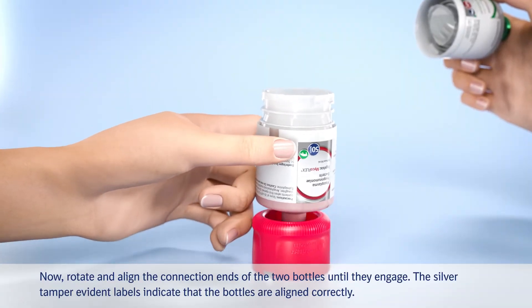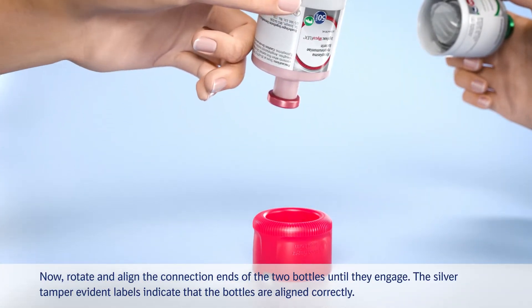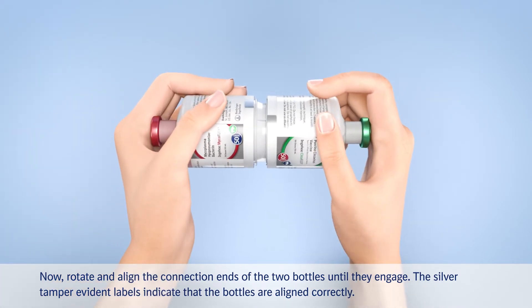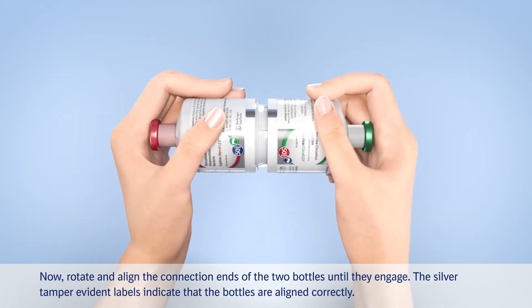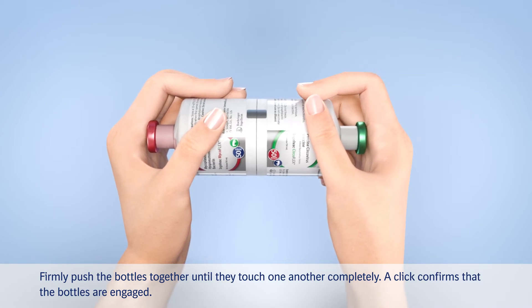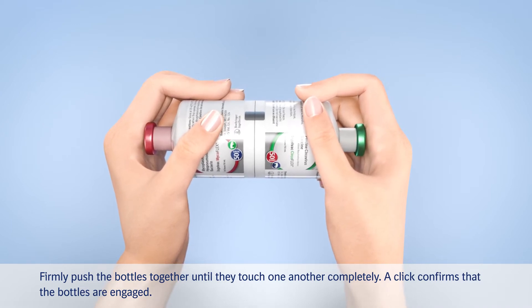Now, rotate and align the connection ends of the two bottles until they engage. The silver tamper-evident labels indicate that the bottles are aligned correctly. Firmly push the bottles together until they touch one another completely. A click confirms that the bottles are engaged.